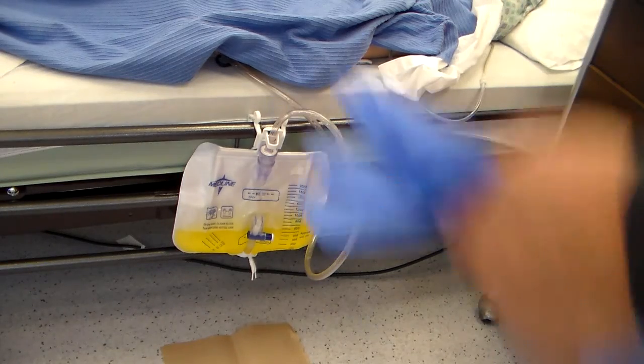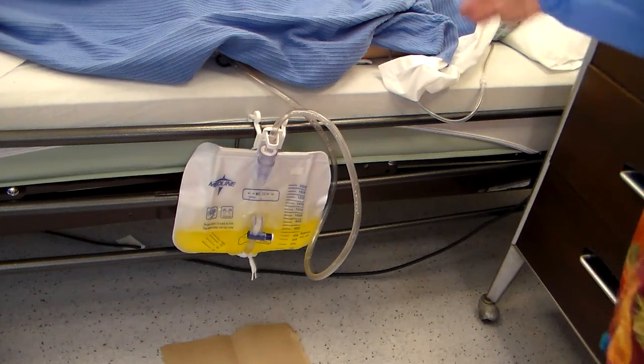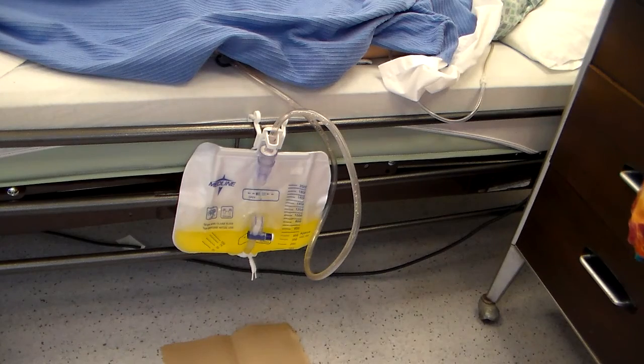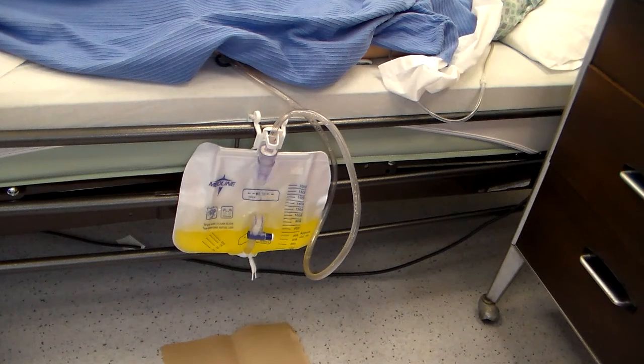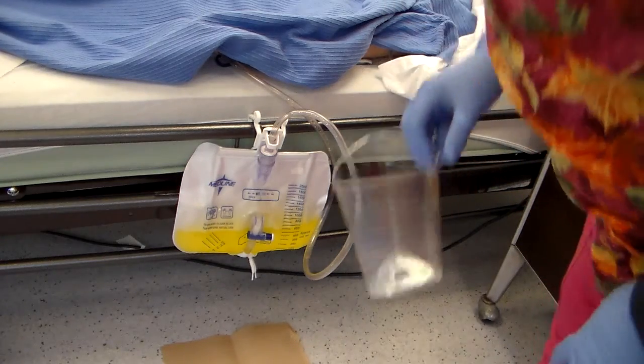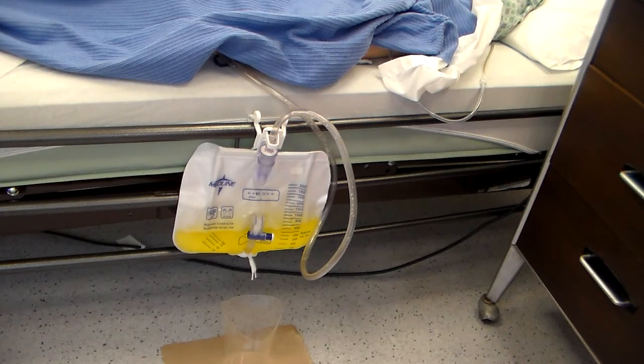All right, so you've gathered your supplies, you have performed WIPSA, and you're going to empty the Foley catheter. You'll have put on your gloves because we're dealing with bodily fluid, and we always want to wear gloves when we're doing that. We have our gloves on, we have our cylinder, and we put the paper towel on the floor. I'm going to try to do this without getting in the way as much as possible. We place the graduated cylinder on the floor, underneath the bag.